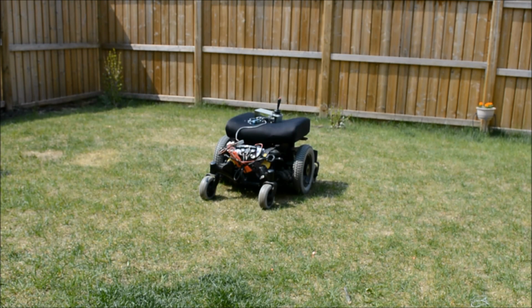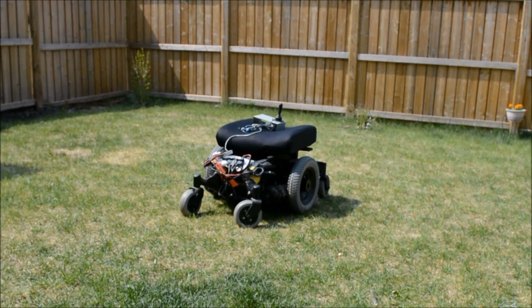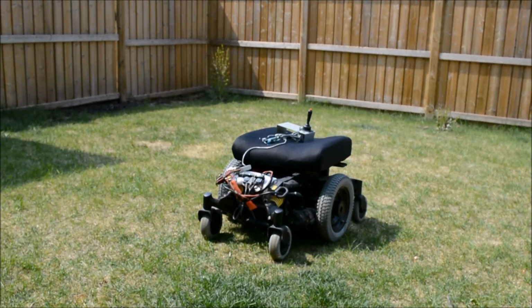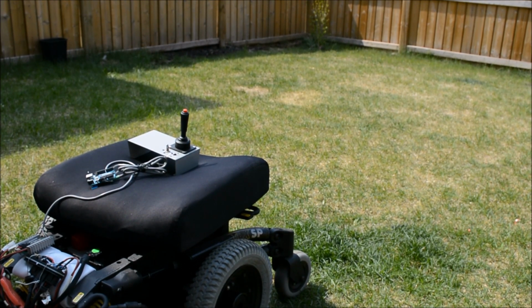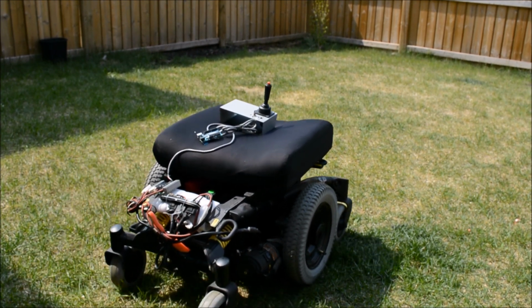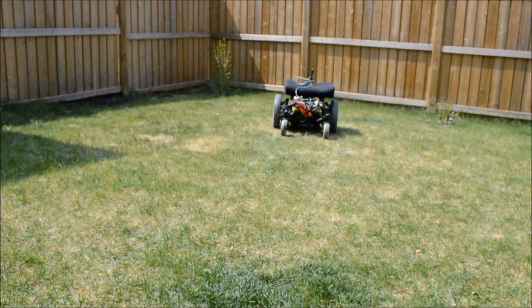Since I'm connected to the Bluetooth of the wheelchair, right now the joystick is disabled. But if I move the wheelchair forward and press forward plus, it will slowly move. And if I press forward plus more, the speed of the wheelchair will increase. And if I press reverse, it will reverse all the way back. And this is the maximum speed I set for reverse.